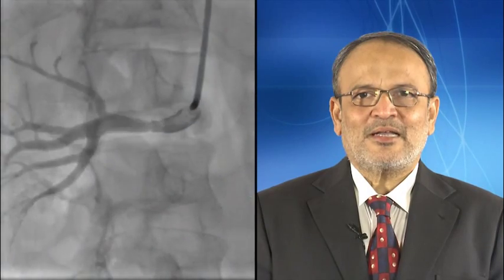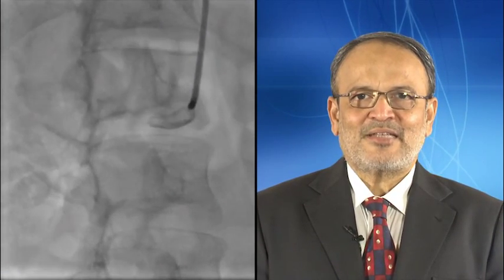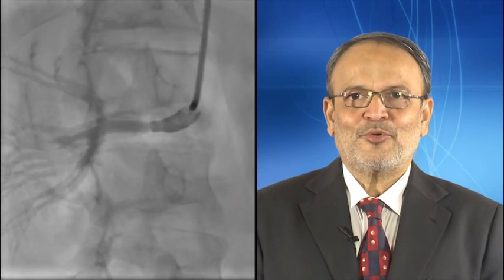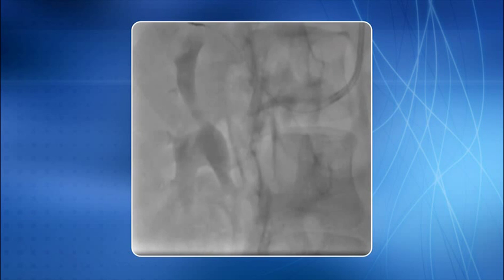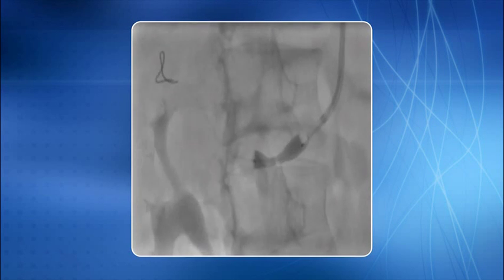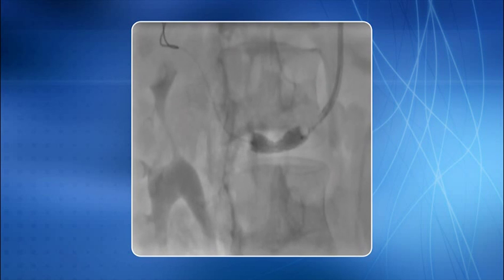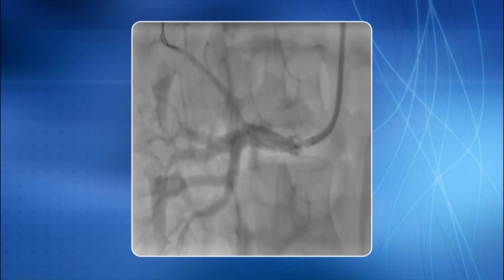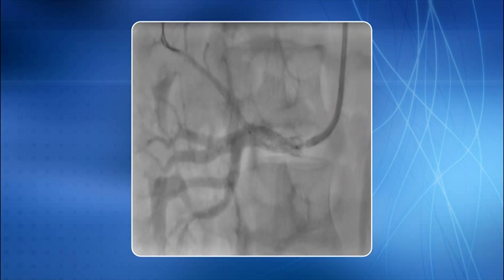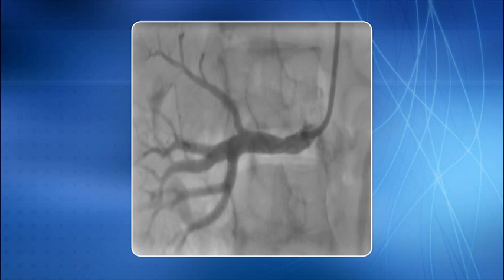This is a case of right renal artery mid-segment stenosis which was stented using a right transradial approach. The lesion is profiled now. This is another view showing the stenting in progress. This is a good end result, shown from another view as well.